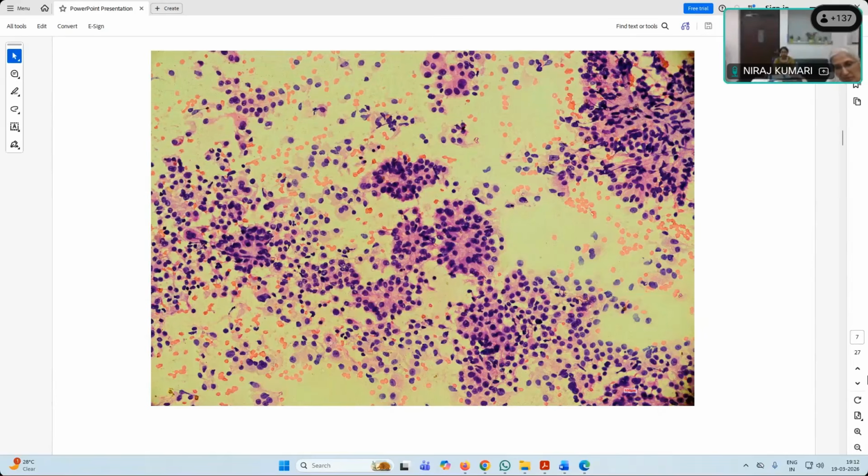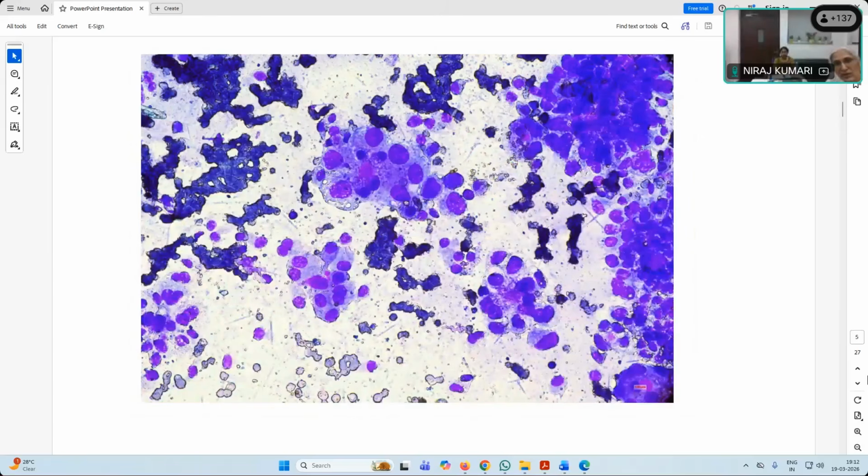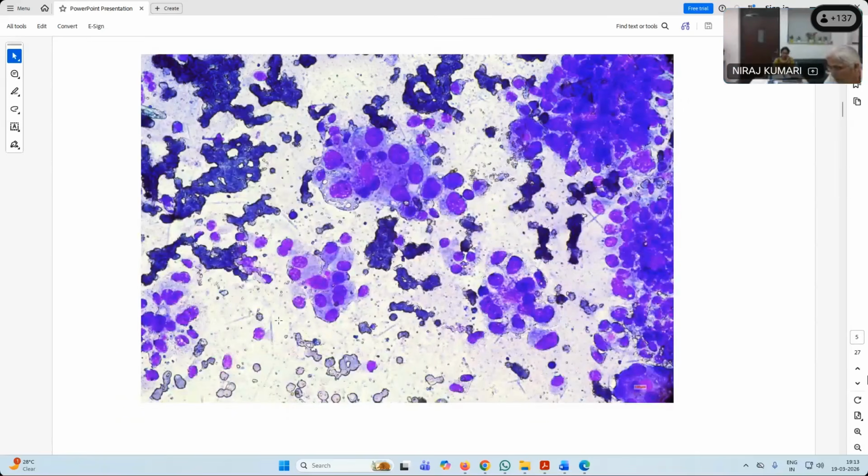Yes. So if you again see these cytoplasm, concentrate on the cytoplasm of these cells. So you rule out the papillary thyroid carcinoma because you don't have the nuclear features. Now cytoplasm is abundant. How is the cytoplasm? If I go back again to this field, it is slightly granular, isn't it? They are granular, they are pale, they are not that dark or dense gray, like squamoid or even like an adeno. Okay, so they are lighter, isn't it? So on further investigation, this patient was diagnosed as having a mass in his abdomen, in his kidney, and this is actually a metastatic papillary renal cell carcinoma.